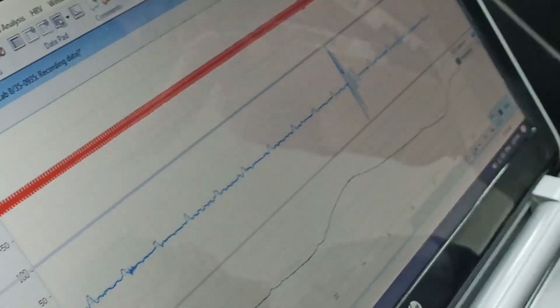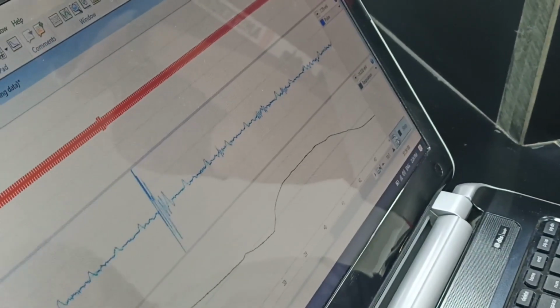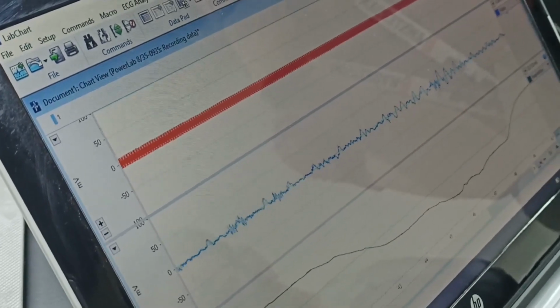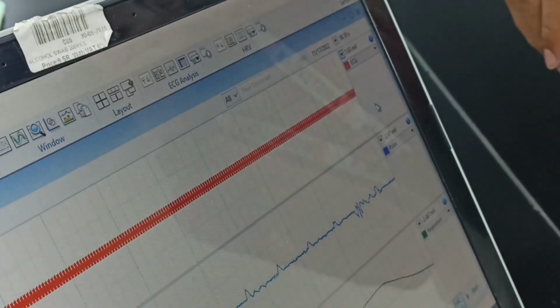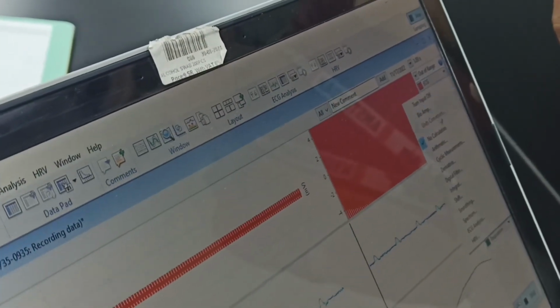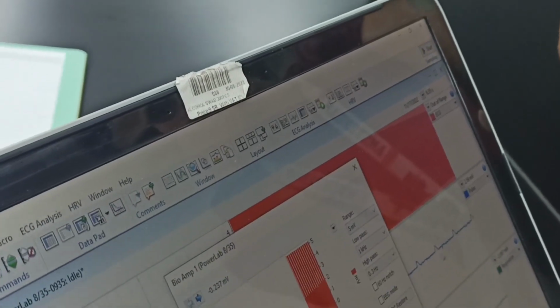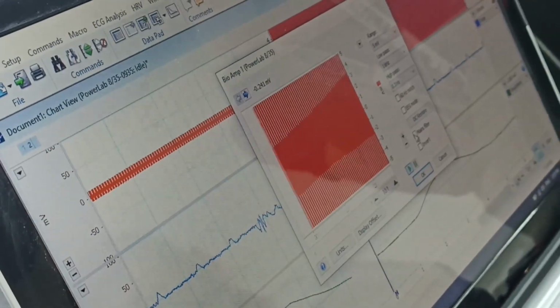Should we encourage voluntary respiration or only involuntary? Should we tell the participants that? We'll have both, deep breaths. Yeah, deep breathing later on. Now for ECG, let us see what happens. We'll have to first go to say 5 millivolts, then we go to bioamp and mains filter.